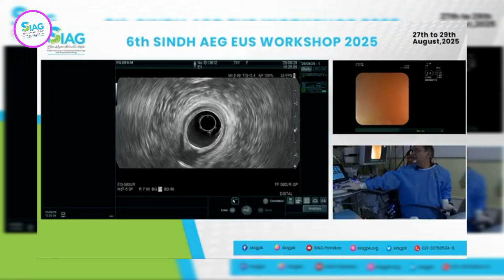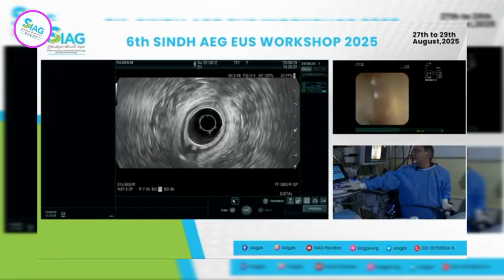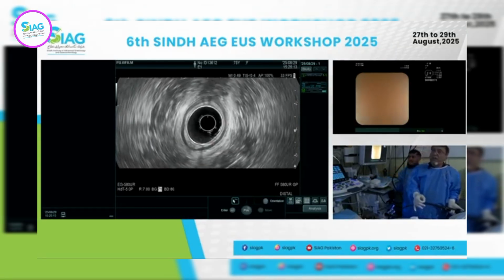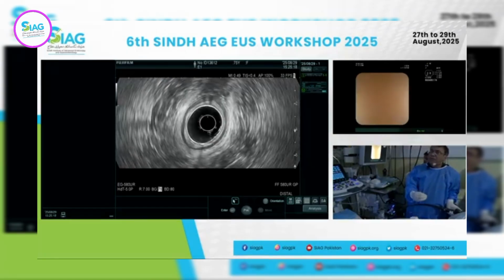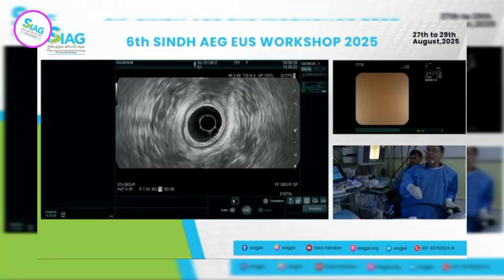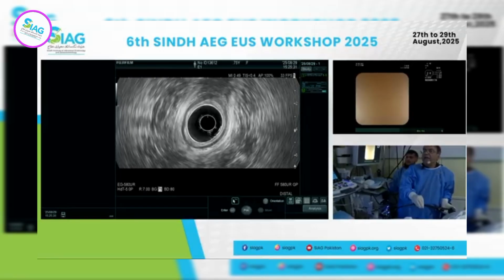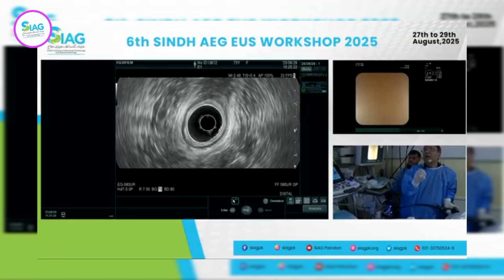Overall, it looks pretty intact right there. So I think that sphincter is okay right here. It looks very intact. External sphincter, I know Nadeem mentioned that it's hyperechogenic. Most of the internal sphincter, you're really going to see very close to the distal anal canal, where the internal and the external sphincters meet. When you get to that point, the internal sphincter becomes a little bit more fuzzy on the outer side, and that shows that that's where the external sphincter is meeting.